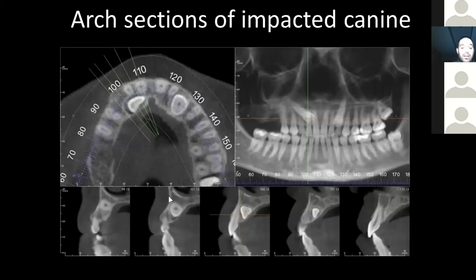And again, my principle: when lost, use the crosshairs. If you just look in any software and start looking for the lines, there's these 5 lines here. They give you exactly these 5 slices right here. This particular green line here is giving us this particular slice with the crosshairs through it. And you'll notice also, in addition to some R's and L's for rights and lefts, I've got a numbered scale on this software here, which is the same number scale here, and each one of these images has a number: 98, 101, 104, 107, etc. They correspond to these numbers here.